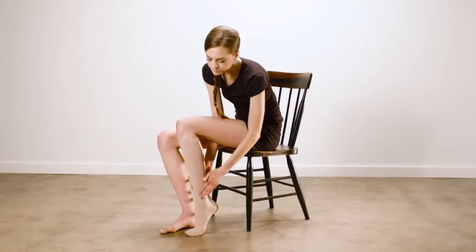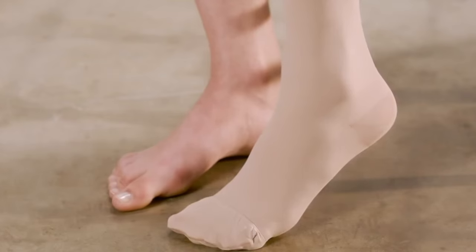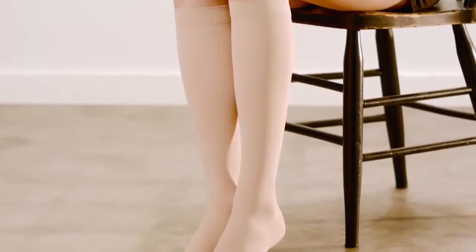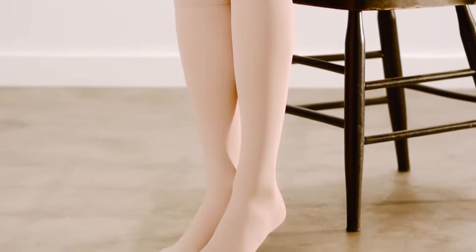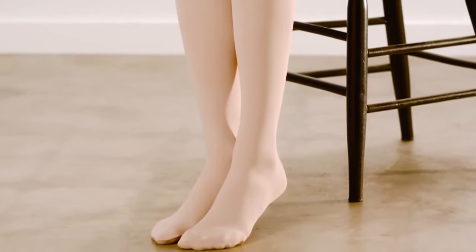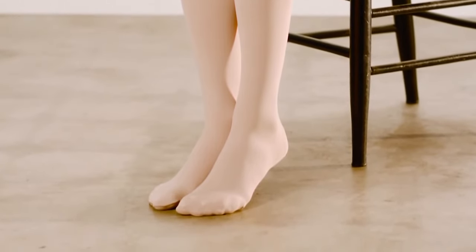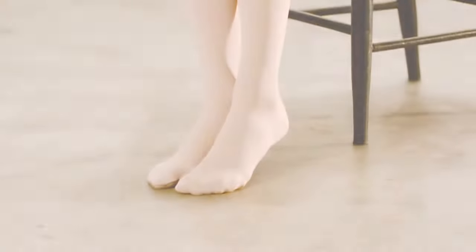Once your garment is on, you'll want to check to see if the foot of the garment fits the shape of your foot. Your stocking should have even compression or elasticity so that the sock takes on the anatomical shape of your foot without high compression or binding points, which may create discomfort or circulation obstruction.